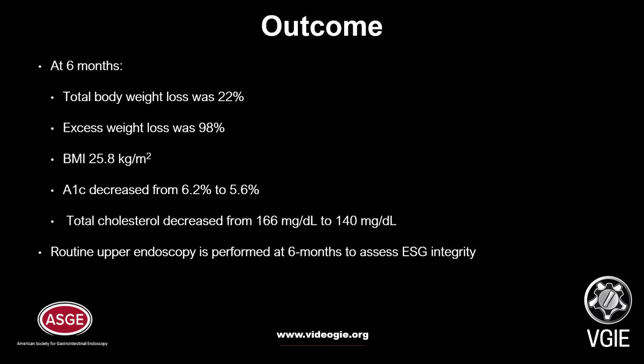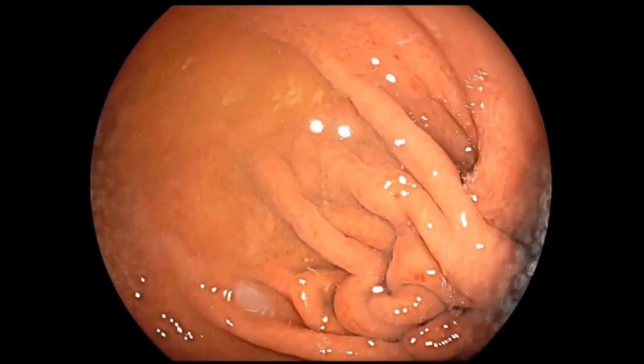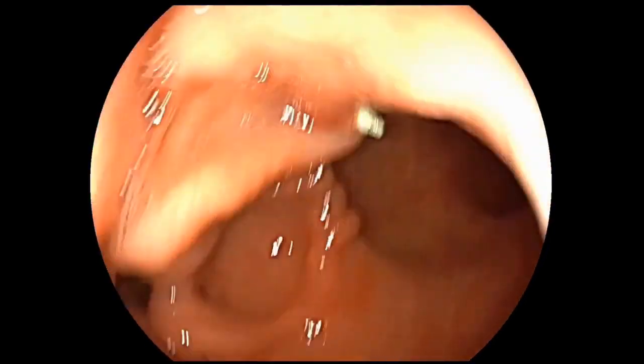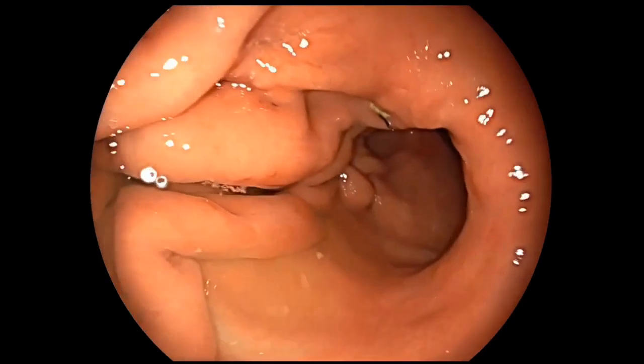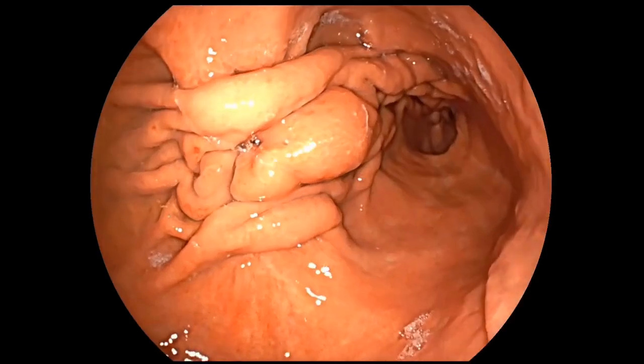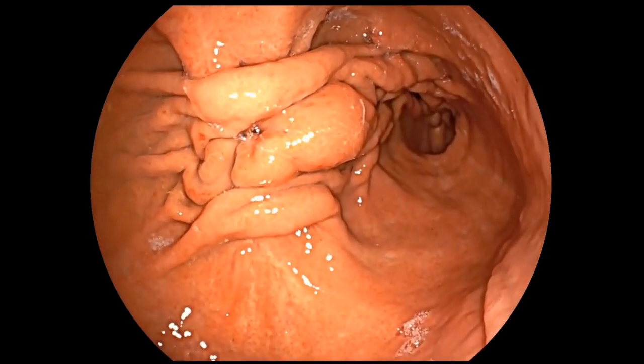Routine upper endoscopy is performed at six months to assess ESG integrity. Endoscopy performed at six months reveals an intact endoscopic sleeve gastroplasty with a tubular gastric lumen and reduced distensibility at maximal insufflation. The suture line is completely intact and without visible suture material.